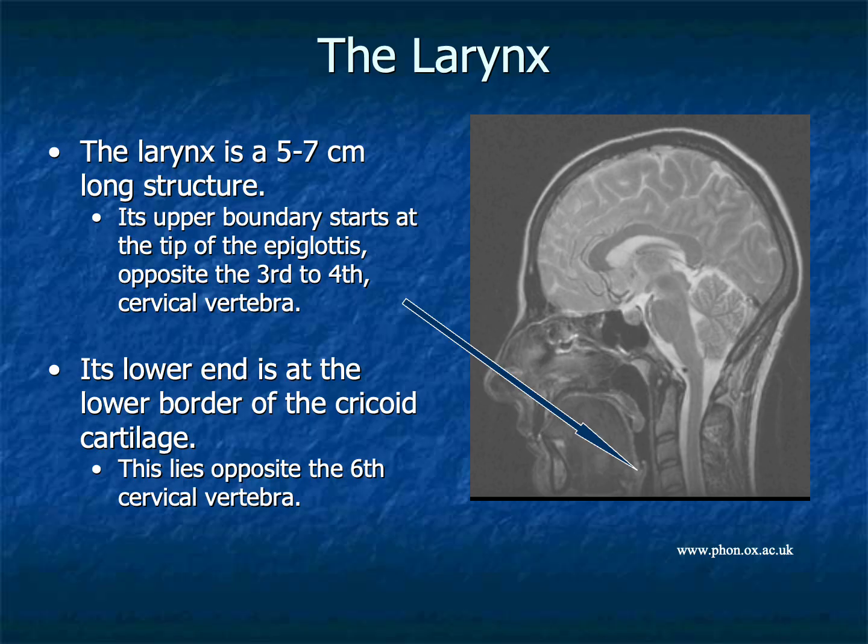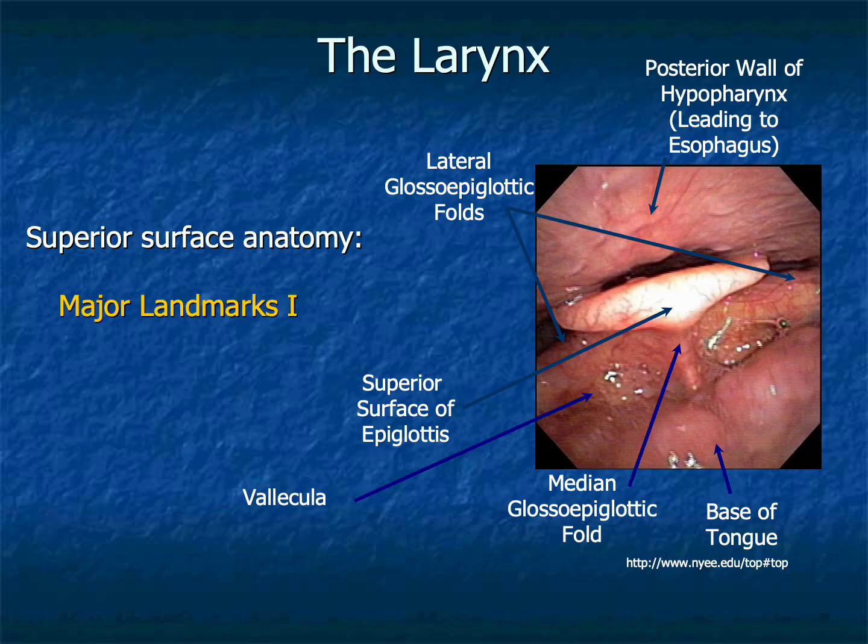One of the remarkable aspects of bronchoscopy is how quickly anatomy transforms from abstraction into a recognizable landscape. Over time, the larynx ceases to appear visually confusing. It becomes organized, familiar, and interpretable. It's sad that so many bronchoscopists neglect a careful examination of hypopharyngeal, pharyngeal, and laryngeal structures.